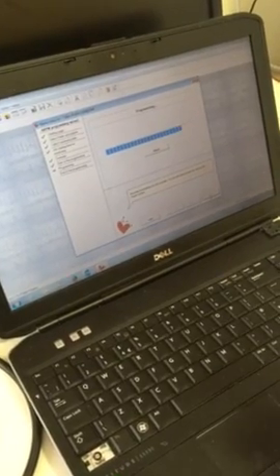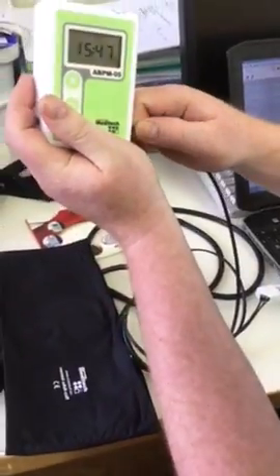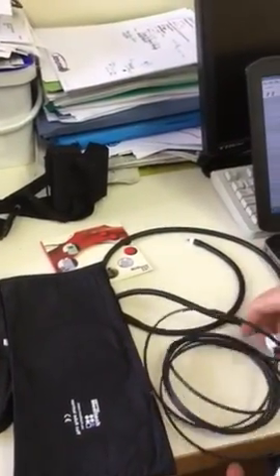So the CardioVisions on your computer will tell this box what to do, which is the standard way of operating, which is hourly at night, 30 minutes during the day. The wizard has completed its job, finished. We're done, so we're ready to go. So you remove this and out. The box is ready.